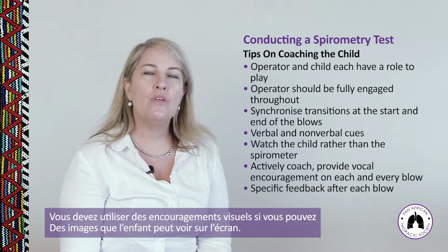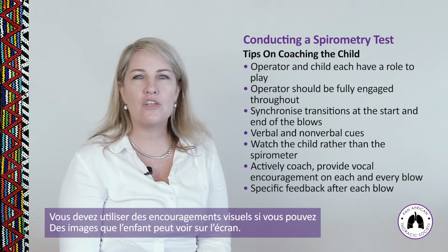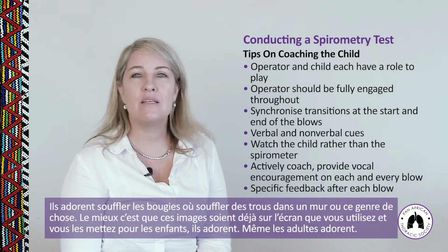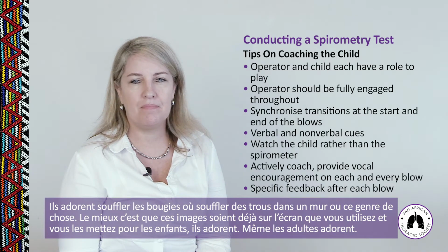You need to use incentive graphics if you can. So that's pictures that the child can look at on the screen. They love to blow out the candles or blow bricks out of a wall or whatever the incentive graphic is on the spirometer that you've got. Put that on for the children. They love it. Even the adults love it.